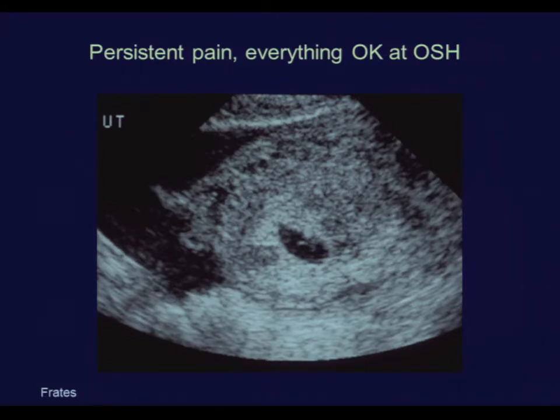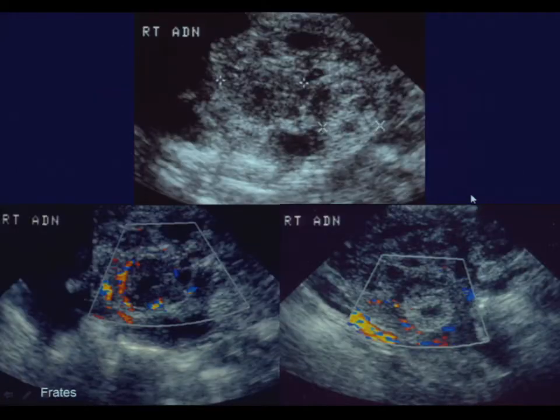So we did another ultrasound on her, and we can see certainly an intrauterine gestational sac. And within that sac, I don't know if you can appreciate, there's at least one and possibly two yolk sacs. So we're clear we have an intrauterine gestational sac. We may even have an early twin gestation. But notice there's a lot of complex fluid around the outside of the uterus. Over in her right adnexa was a very large heterogeneous mass. Really could not figure out whether this was the ovary or not.